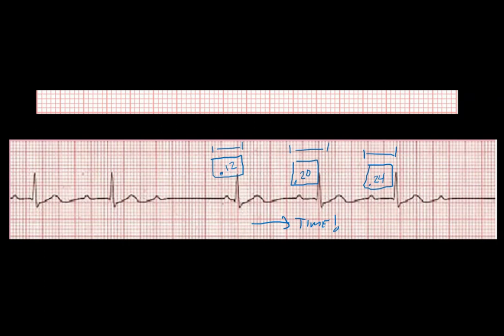I'm not really concerned on the vertical axis whether or not it is anything for amplitude right now. I just want to know, is it positive or negative? Just helps me identify what those waves are. Let's move on.